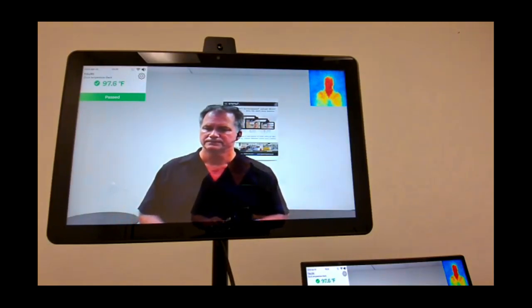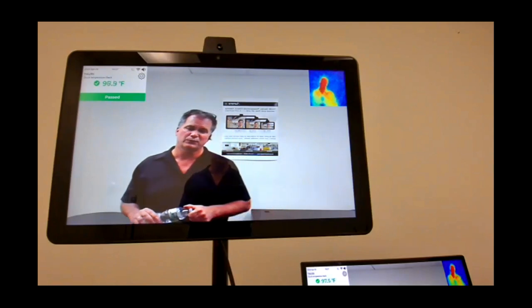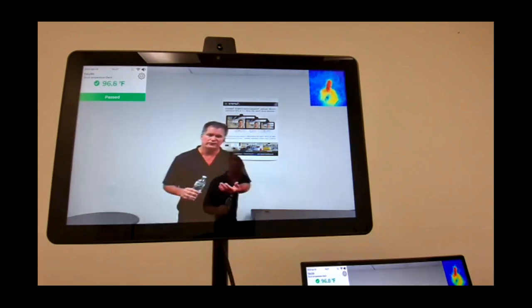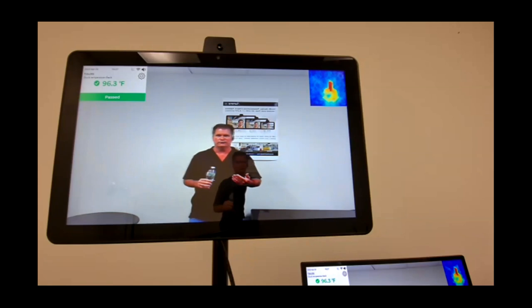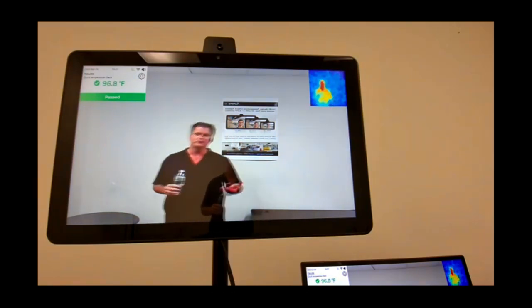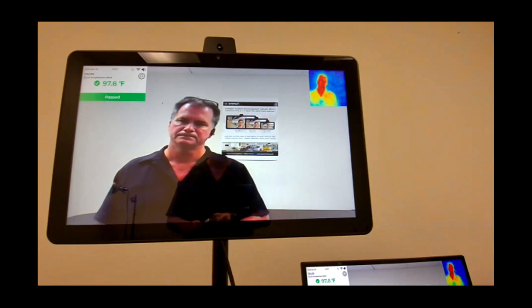Question: does the device need to be pointed at a blank wall — does wall color or material affect readings? No impact from wall color. As for personnel in the background: that's something to manage, because as you can see I'm registering from farther away, so someone standing behind the person being checked, even at a greater distance from the device, would contribute to the overall temperature read.